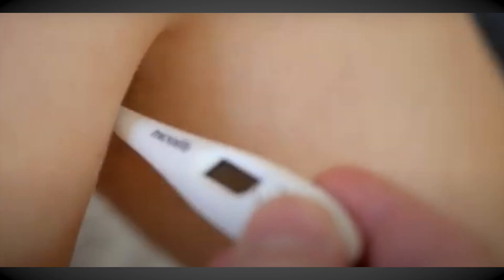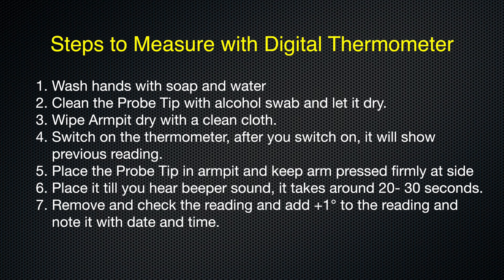Place the probe tip in the armpit as shown and keep the arm pressed firmly at the side until you hear the beep sound. It takes around 20 to 30 seconds. Now remove and check the reading — add plus one to the reading — and note it with the date and time.